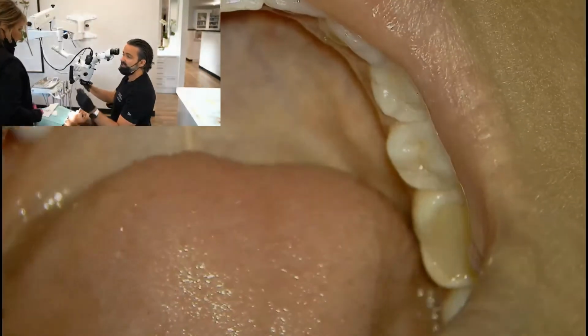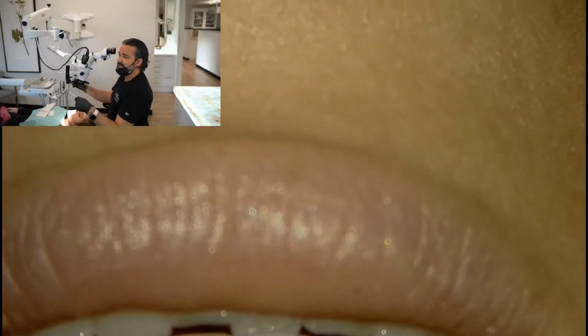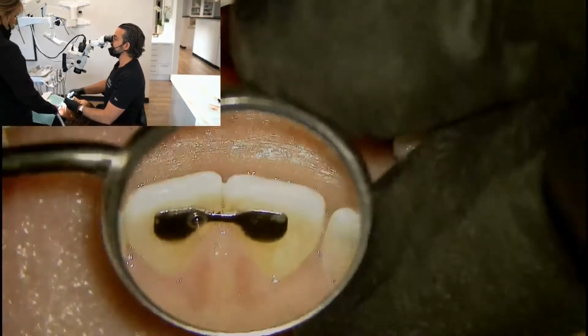And it's just because you're working room to room, which speaks to how you use a microscope in your operatories. So in my operatories, we work with microscopes in every room. And there are different doctors in each room. So there's a lot of tweaking that goes along like that.